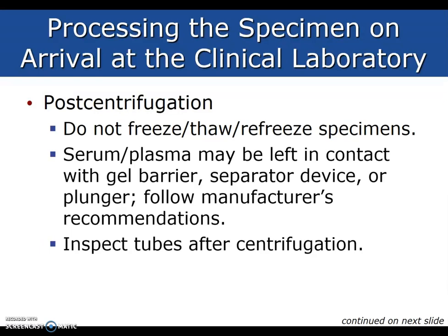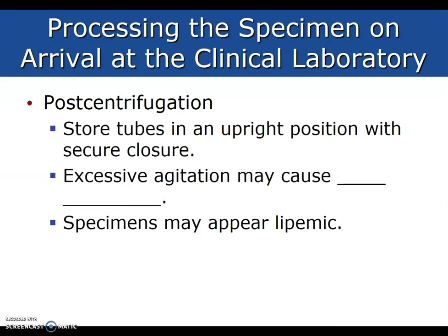We're also going to look for hemolysis. We're going to store tubes in an upright position with secure closure. Excessive agitation may cause hemolysis of our specimen, and specimens may appear lipemic, which is that milky, cloudy appearance of the serum or plasma.